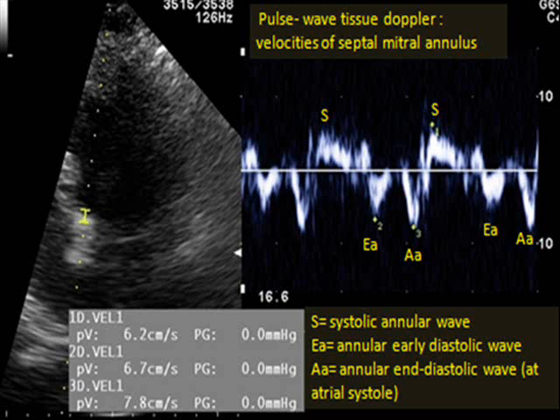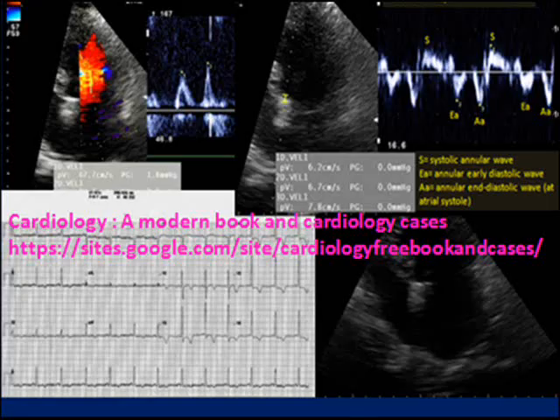Normally, at the septal mitral annulus the peak early diastolic E velocity should be over 8 cm/s, and at the lateral annulus at least 10 cm/s. A mitral annular E velocity of 5 cm/s or less is an indication of severe diastolic dysfunction and also indicates a worse prognosis.